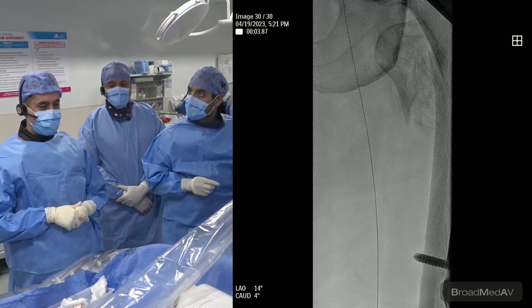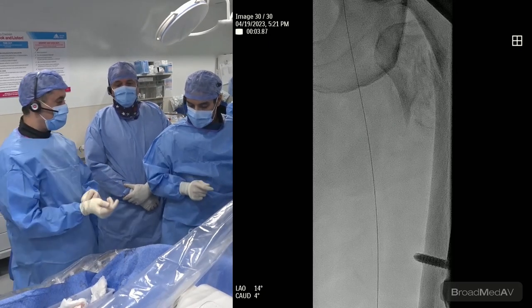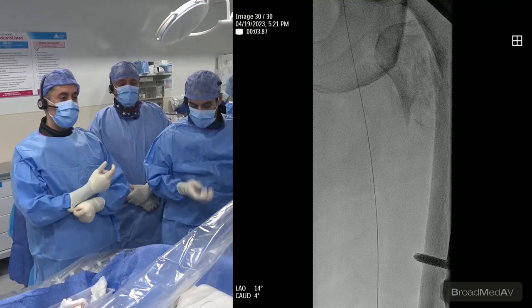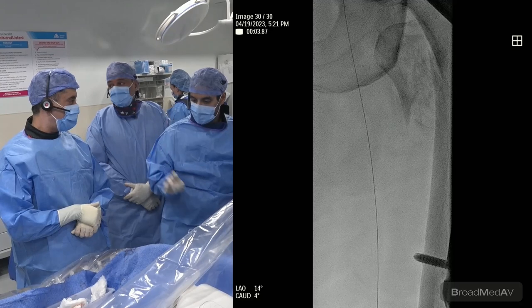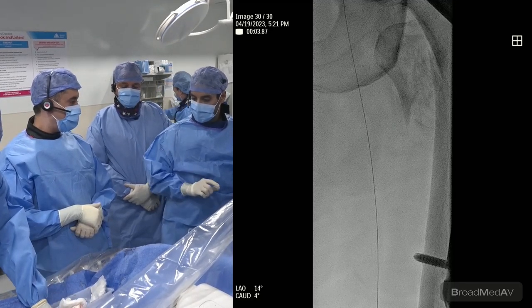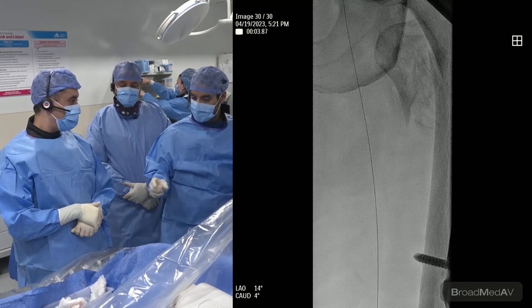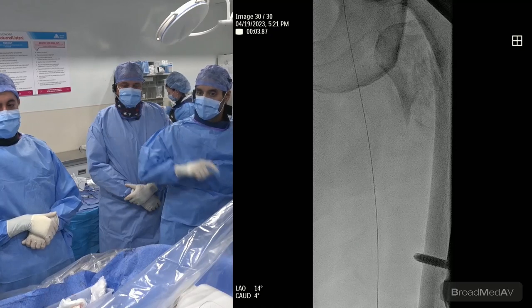Yeah. So we know you have diffuse disease, but you have a total occlusion. So let's put the pressure wire down. Tell me when we can put the pressure wire, guys. Let's do the balloon first. Give me a 5020 balloon, guys, 5020 Vitrac. So focused on just that occlusion, I think we all agree, you may disagree on what the destination therapy is, but that definitely has to be treated, plus minus atherectomy, plus minus stent, but definitely some drug-coated technology.